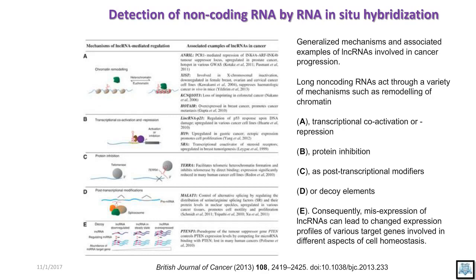They have demonstrated that there are multiple molecular aberrations, with insertions and deletions, and multiple gene fusions occurring in different tumor foci. But those studies did not reveal any targetable molecular aberrations. So we decided to stick with the already established molecular markers, which are known to be driver molecular aberrations in prostate cancer. And the drugs are in preclinical studies, showing the potential of developing specific therapeutic drugs targeting each molecule.